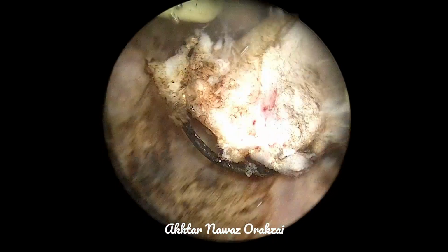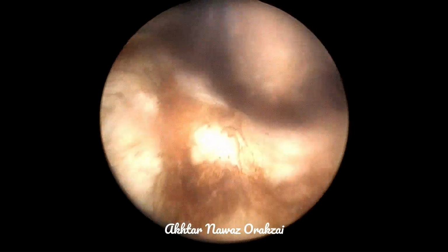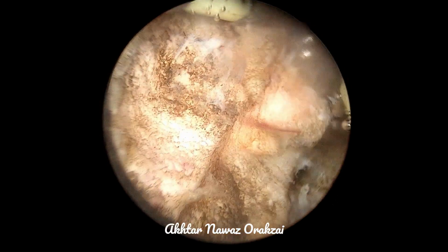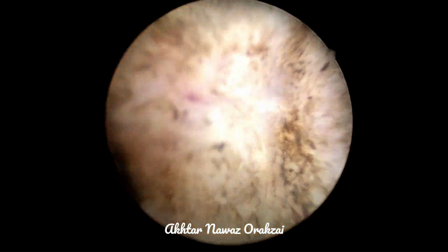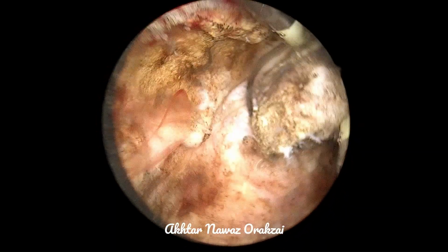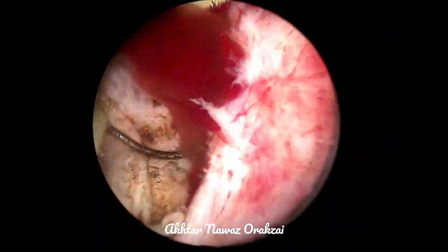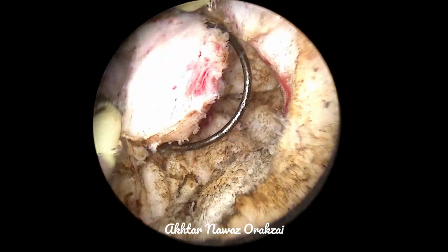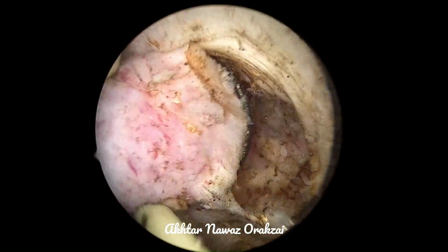The median lobe should not be resected initially in a deep way, because that can lead to undermining of the bladder neck, and this is the most common mistake made by beginners. They usually start resecting the median lobe and keep on resecting until, by the end of the procedure, they come to know that they have undermined the bladder neck. And undermining the bladder neck can have so many consequences, especially bladder neck stenosis. So undermining must be avoided.